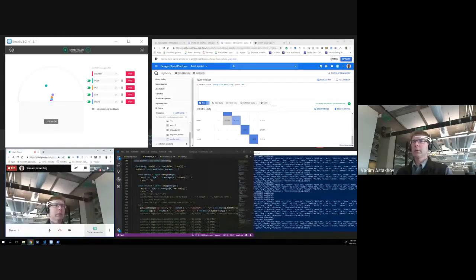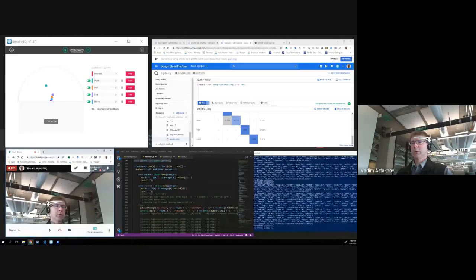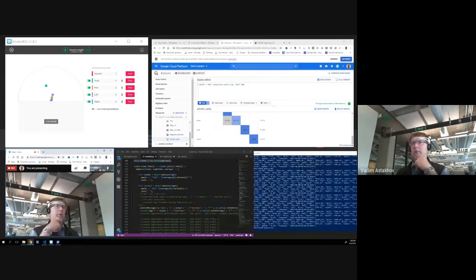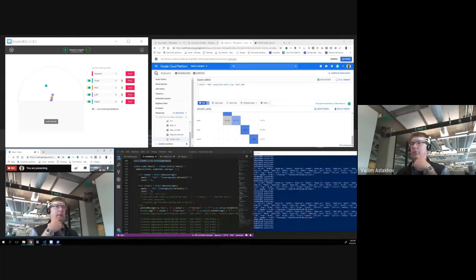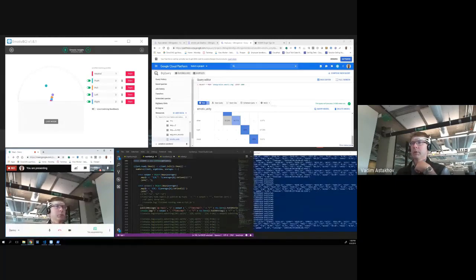In this video, I'm going to demonstrate how to build a model to control a gaming environment using brain-computer interface. As you can see, I wear it right now, and this device can collect the signals from the brain waves, and I can train the machine learning model to control various environments. And as an example, I will show how to control game environment Unity.